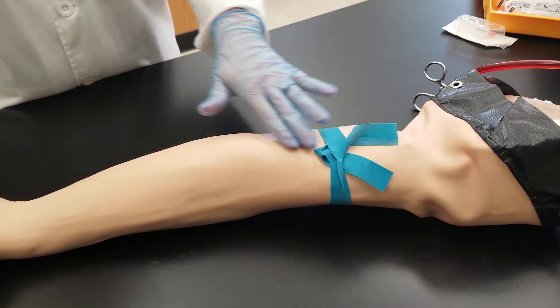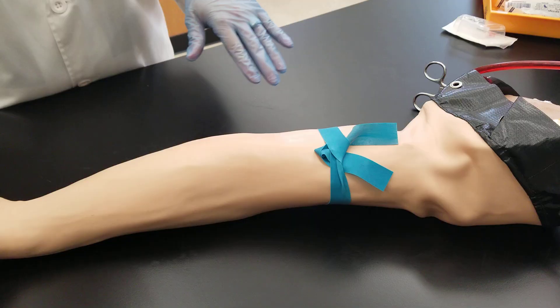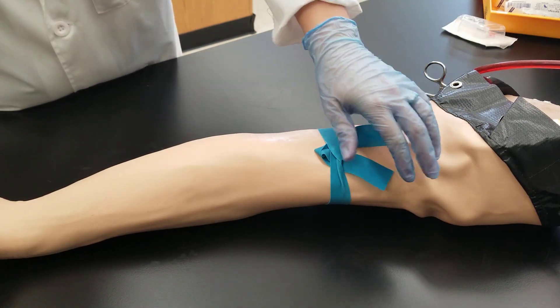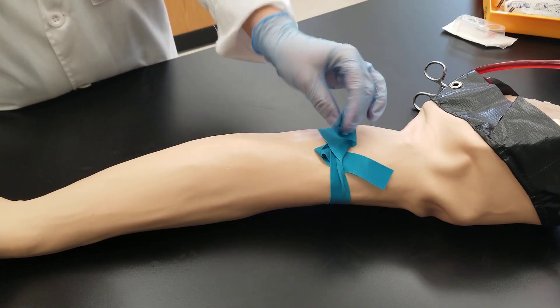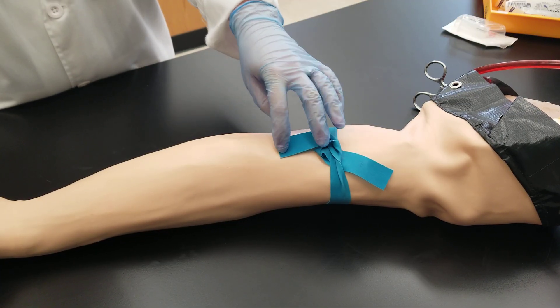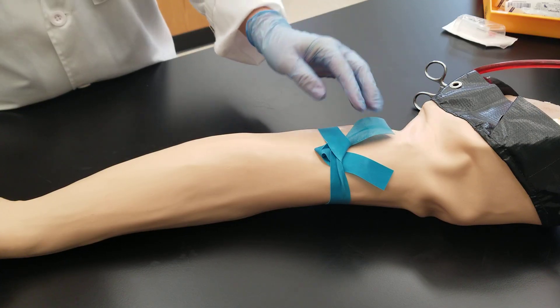This is the way that the tourniquet should look after application. Notice that the tails of the tourniquet are facing up towards the patient's arm — that is the way you want to do it, because you don't want your draw spot to be contaminated after you've cleaned it, or you don't want it to block where you're going to perform your venipuncture.